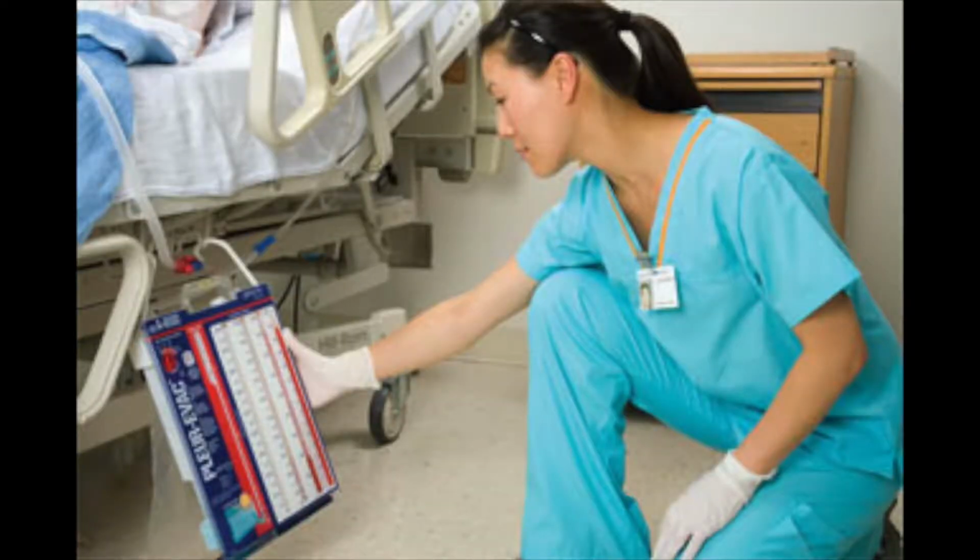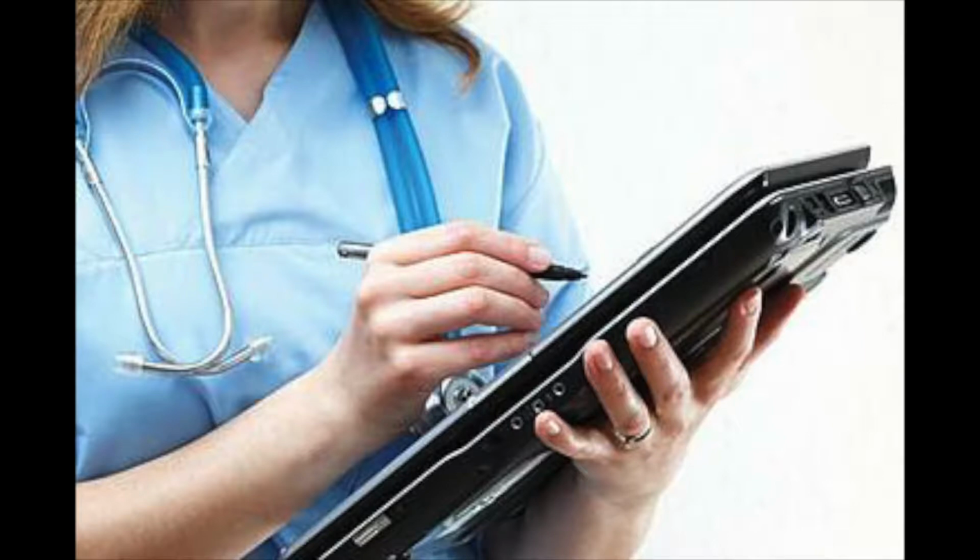Okay, the first thing I'm going to talk about is the scope of practice for chest tube insertion, removal, and management. As far as nurses are concerned, they are responsible for the care and maintenance, as well as assisting the provider with placement and removal, as well as any documentation pertaining to the color, type, amount, or consistency of the drainage.